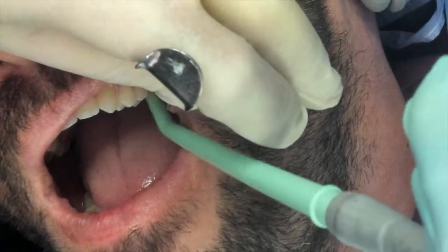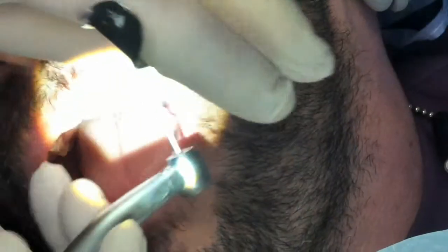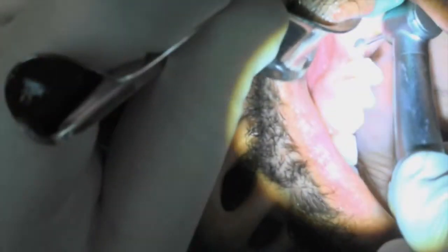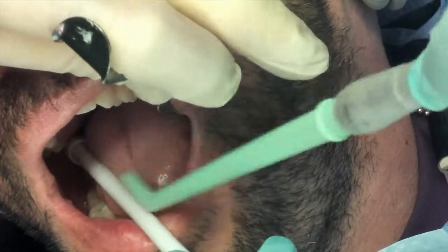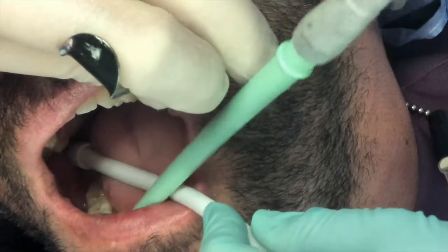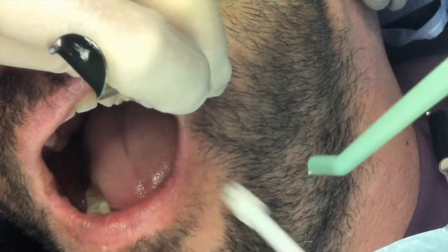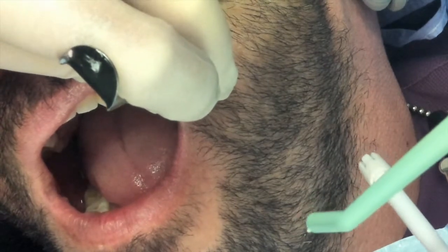Now, one of the things to remember from all of this, when we start talking about implants, is the head of the implant and the type of implant system chosen, and the ability to have some of the superior aspect of the implant either be prepared or be altered. You could do this to a titanium implant, but you start creating all kinds of issues at the bone level. It's one of the reasons that I pick Z systems, is I like to have flexibility with their implant, that I could prep it if I have to. I can make adjustments if I have to.